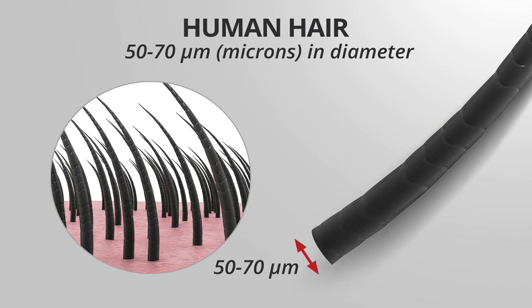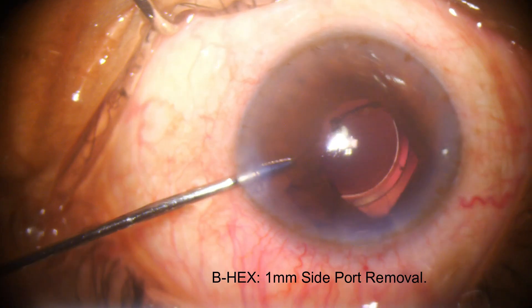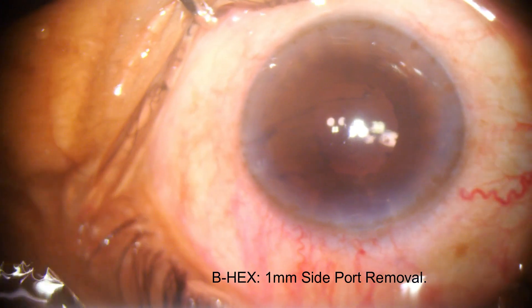Being as thin as a hair, it can be removed through a 1mm side port incision — a feat which no pupil device has been able to achieve.